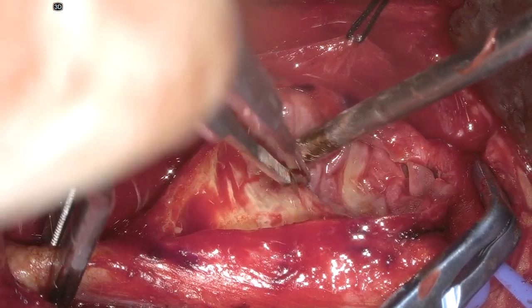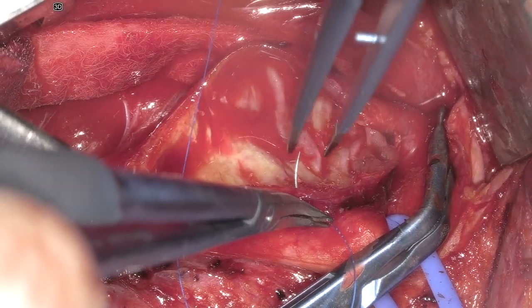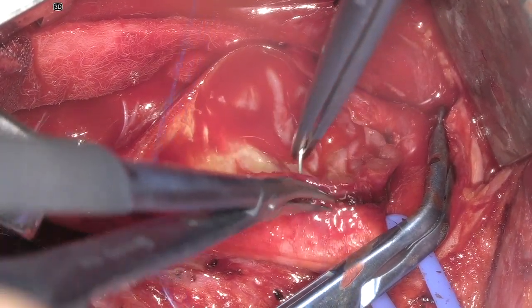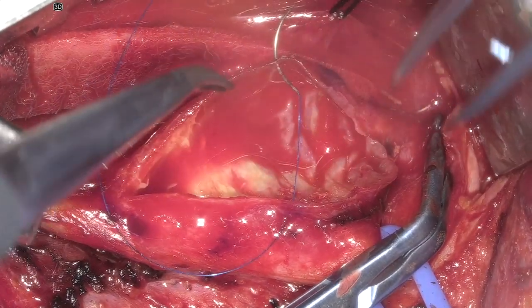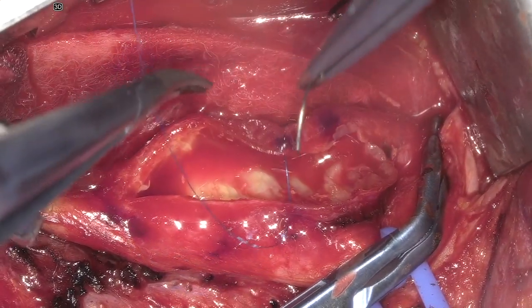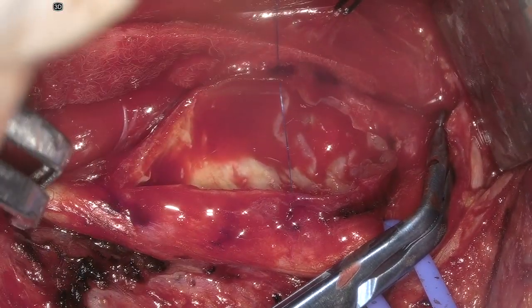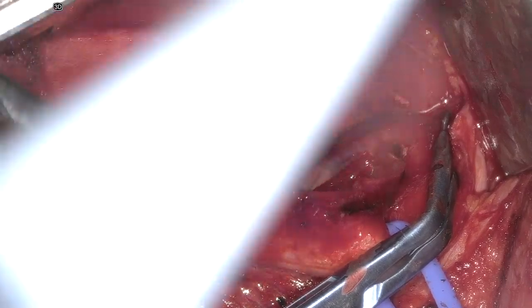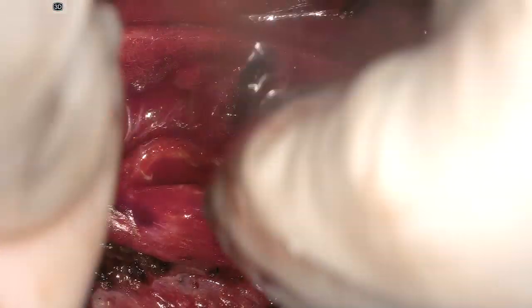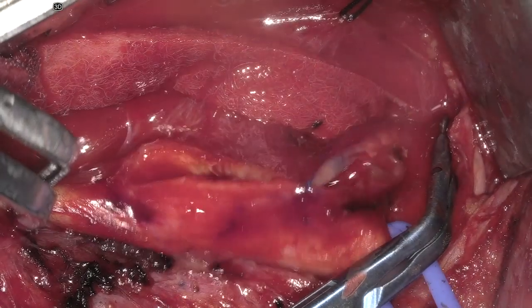I like to put a middle stitch in before starting closure just to get the two sides lined up and avoid any dog-earing. By putting this first stitch in — which I tie with my hands using 6-0 prolene — I can ensure that the two sides of the arteriotomy line up well for the continuous stitch.